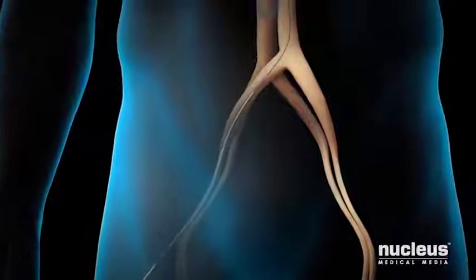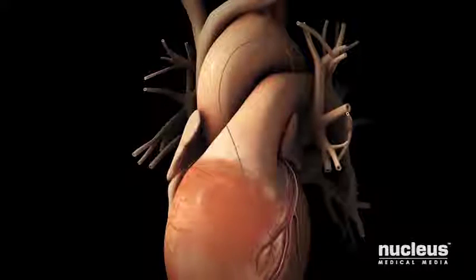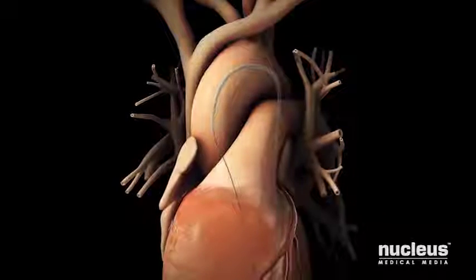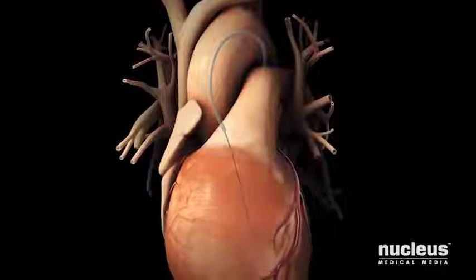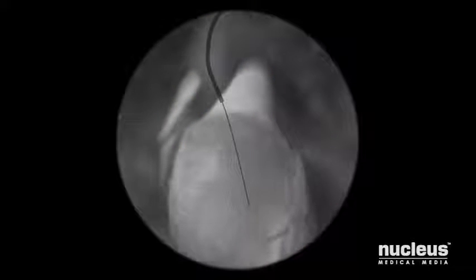Next, the guide wire will be advanced up to your heart. A flexible tube, called a catheter, will be advanced over the guide wire and brought into position near your coronary arteries. The procedure will be monitored using an X-ray imaging device called a fluoroscope.